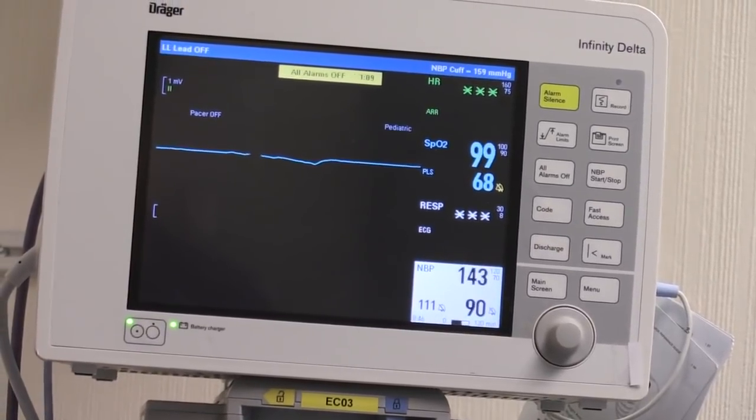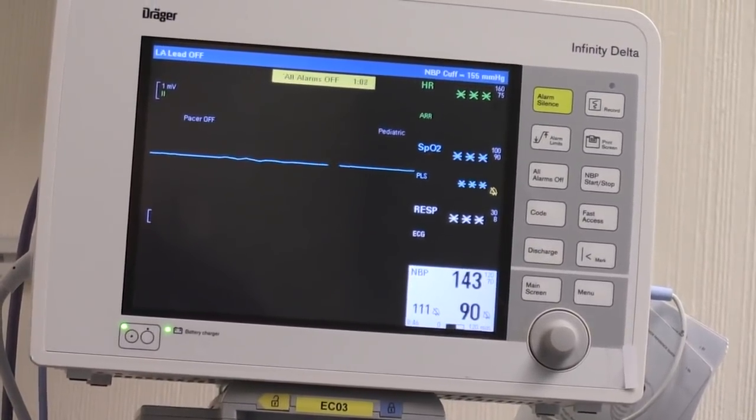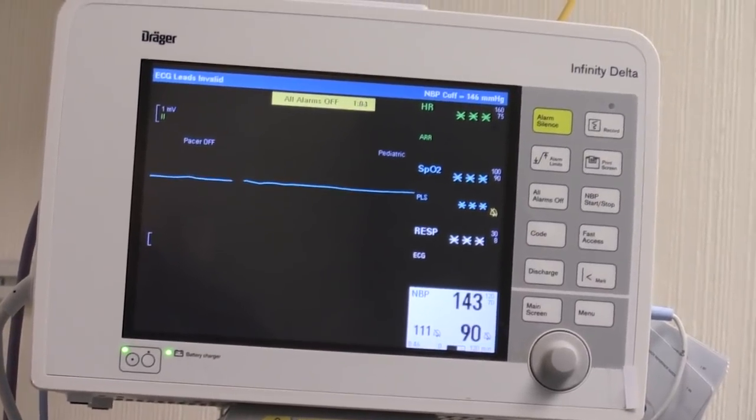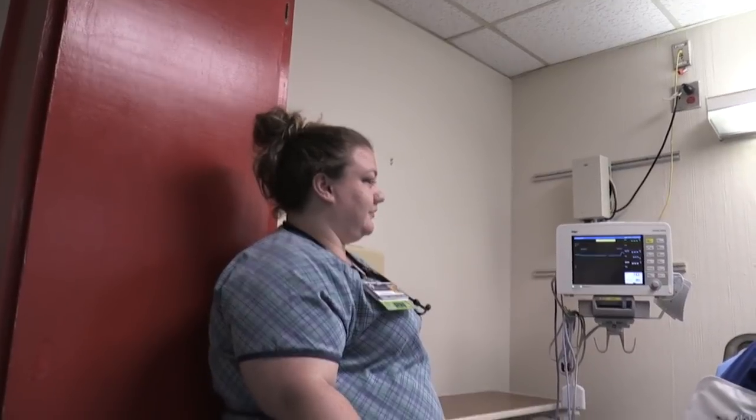Yeah, we did. No more waveform. No more read. All right, so the lesson here is pulse oximetry and blood pressure on opposite arms. There we go. Thank you.